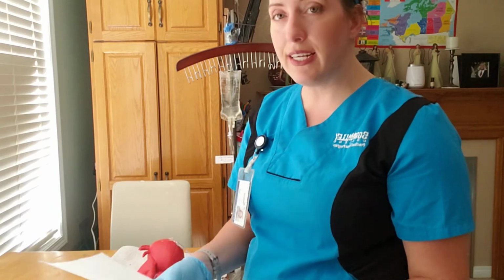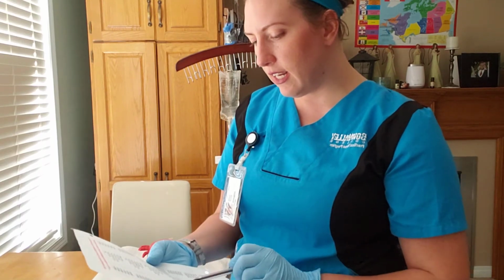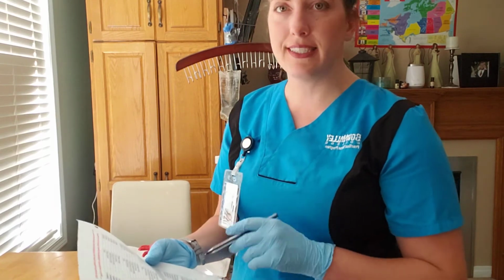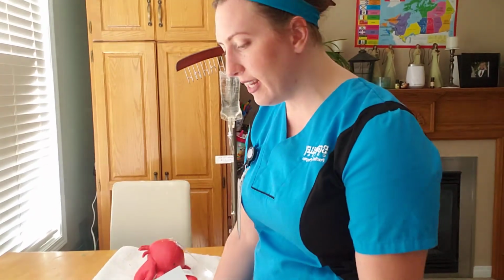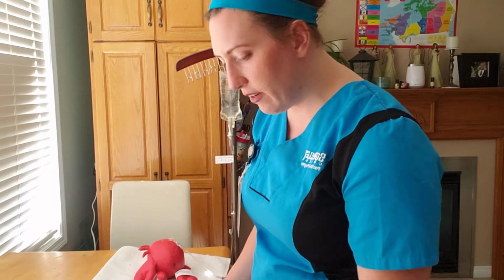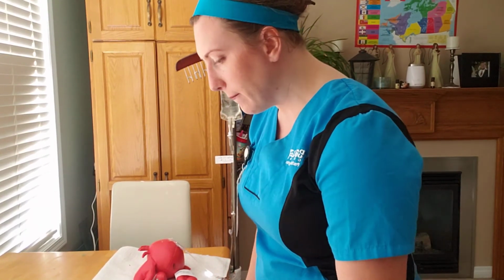Okay, so again, what I'm gonna do here is I'm actually just gonna take a double check on my compatibility chart to make sure ranitidine is compatible with that solution, the 0.9% sodium chloride. And I'm seeing here ranitidine, 0.9% sodium chloride is compatible, so we're safe there. As well it does indicate the same thing on the monograph, that is recommended for the infusion to dilute with saline.